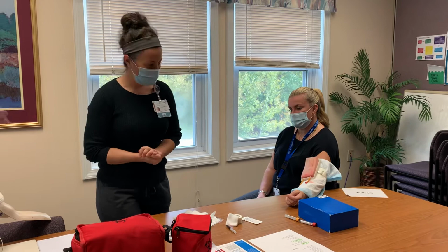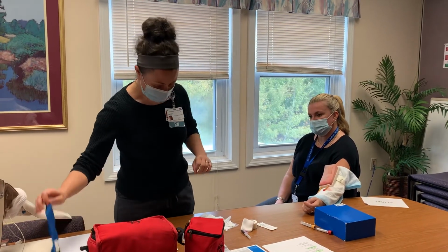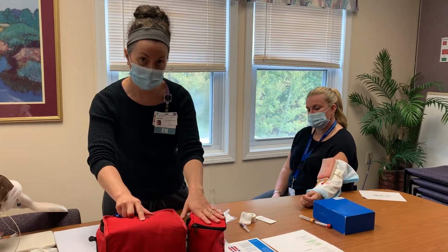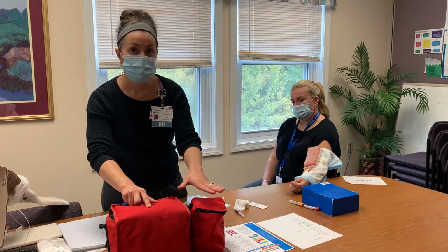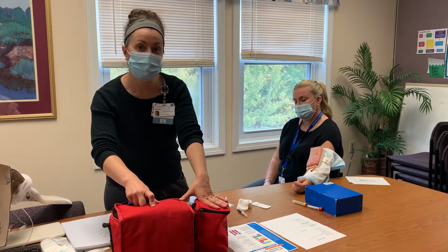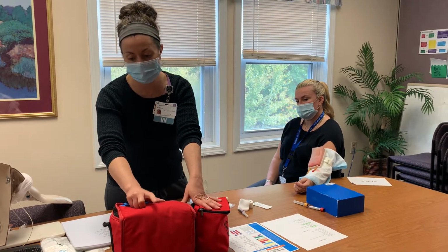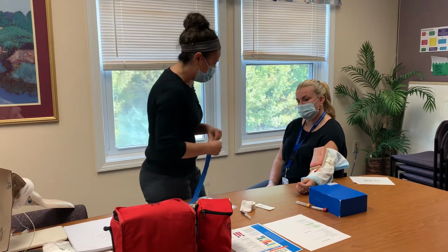All right, so I'm gonna wash my hands first. I'm bringing in my supplies using my lab bag. Also as a reminder, when you're carrying specimens to and from the patient's home and to the lab, to the hospital, always be transporting that in a lab bag. That is protocol.